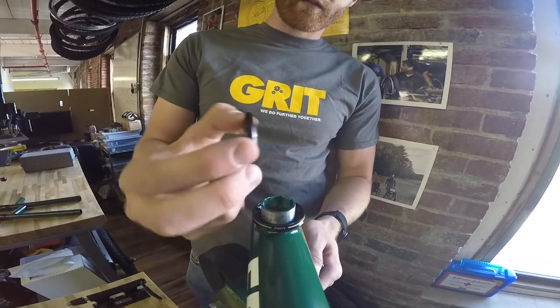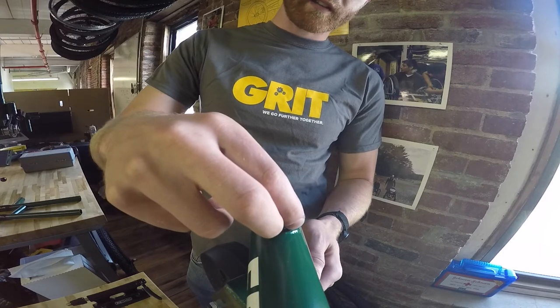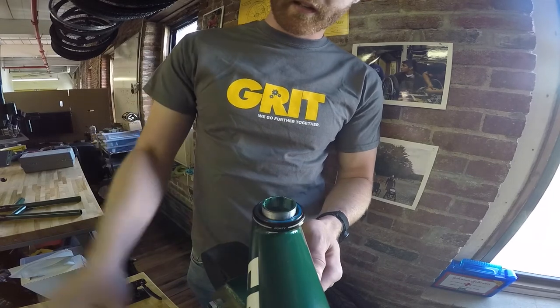Then you want to take your other bearing with the chamfer down this time. Basically, the chamfer is facing into the headset of the Freedom Chair. Place it in there.